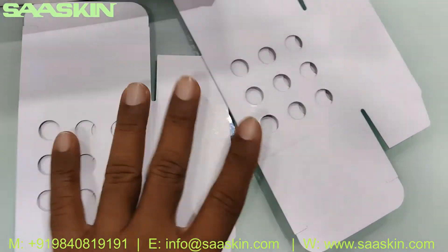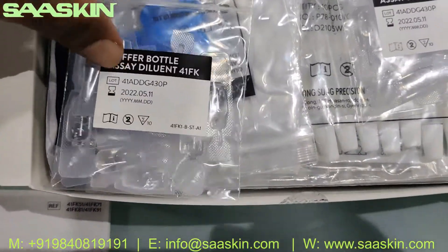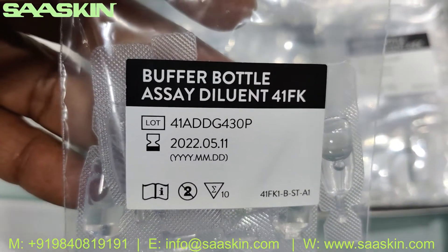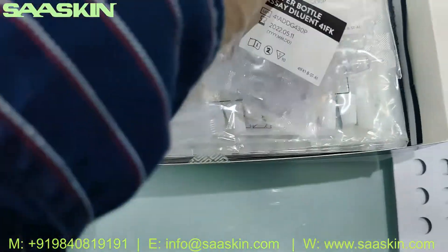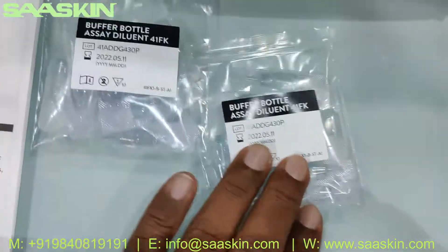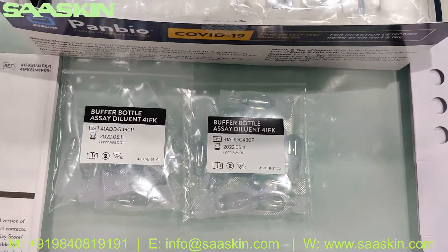Then you have two paper stands. You can also see the buffer — the diluent, the buffer bottle — individually packed. There are two packs, each containing 10 units. You can see the individual buffer liquids here.